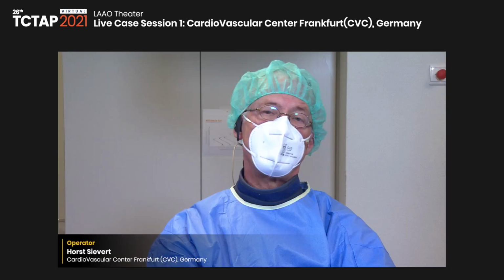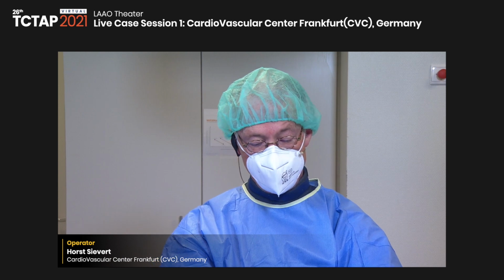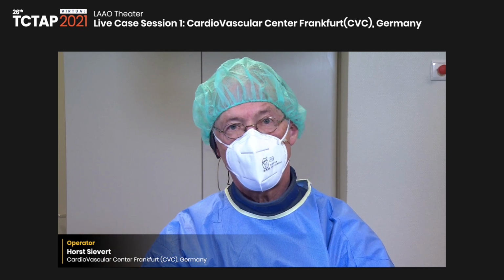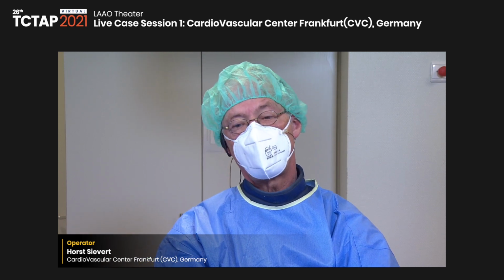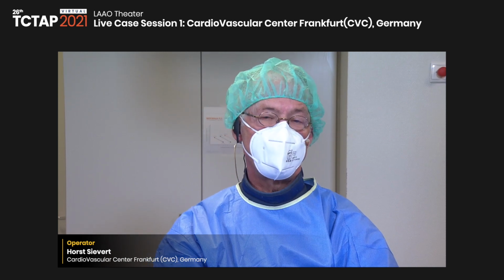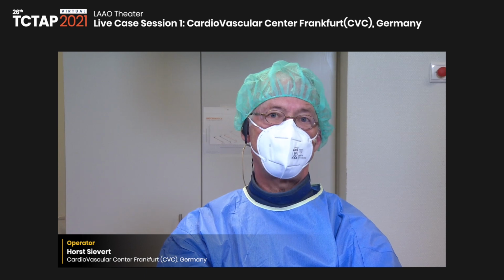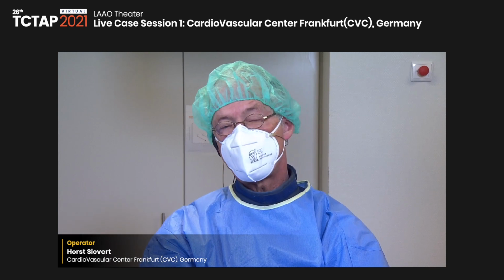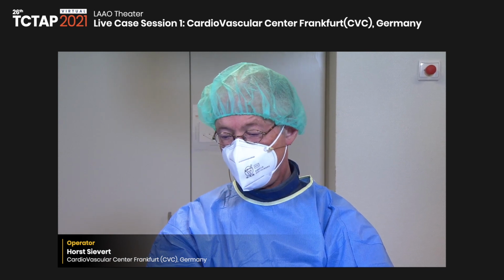That's a good discussion. I mean, the only reason why we exclude patients with valvular heart disease from LAA closure is the observation that these patients more frequently have thrombus somewhere else than in the left atrial appendage. But I think everybody will agree that clot formation outside of the left atrial appendage in mild mitral stenosis is really very rare. So if you have severe mitral stenosis, that changes everything. But in mild or even moderate mitral stenosis, clot formation outside of the appendage is extremely rare. So I would not have a concern in this patient here.